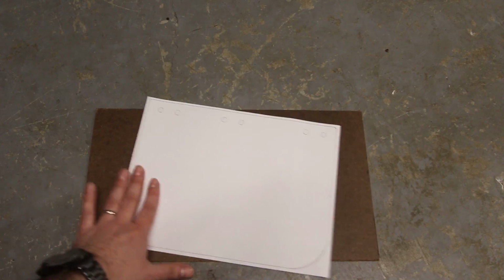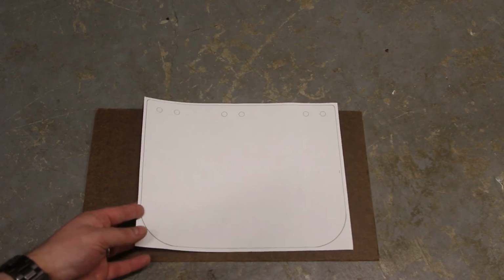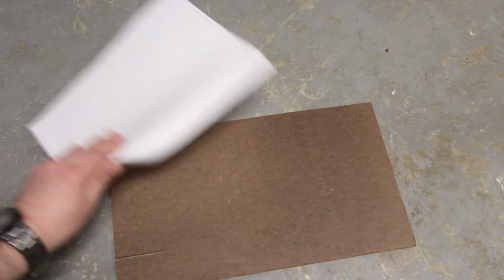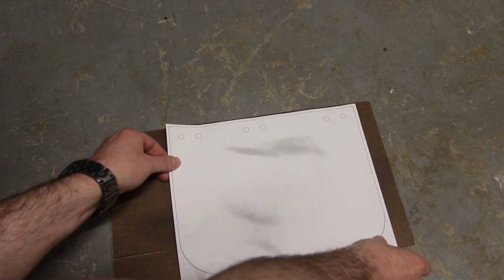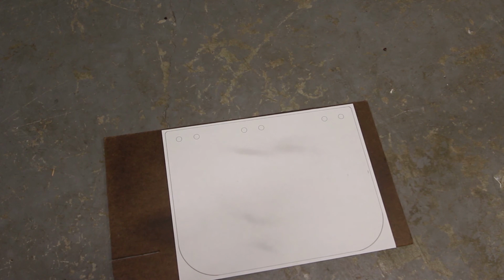Okay, so right now we have our paper template for our visor shield, but this paper template is not going to be enough for what we need to do. So what I did was I just grabbed an old piece of paneling that I had lying around, and we're going to use a little bit of spray glue here. And we're going to put our template on our piece of paneling here. And after this dries, we'll then cut out the template, but instead of it just being a piece of paper, it's going to be a piece of paneling, which will be a bit more substantial and easier to work with.